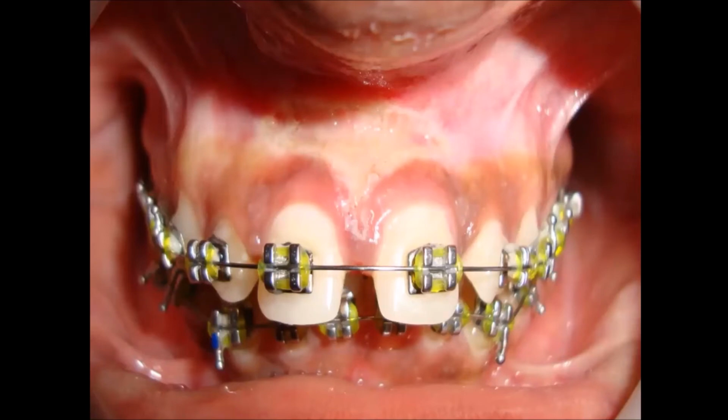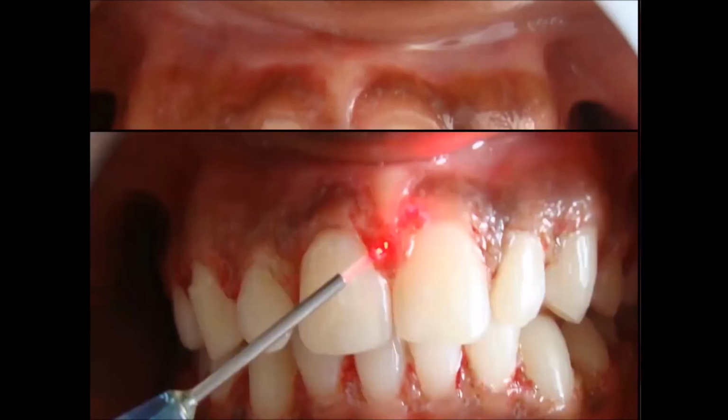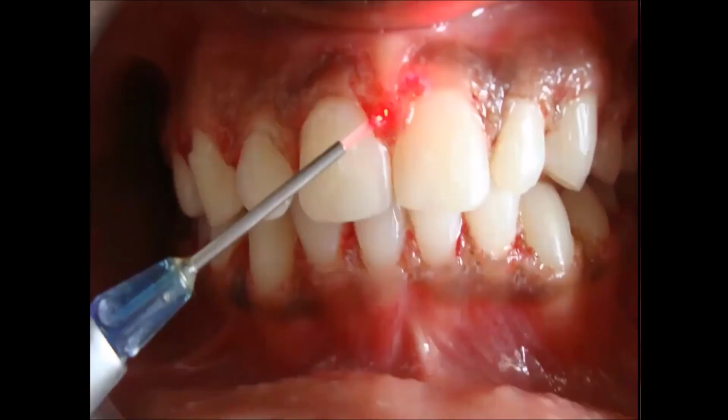Now, what is a frenum? You can roll your tongue on the front portion of your upper lip, and you will see a fold of tissue there. And that tissue removal is what we are showing right now, which is called frenectomy. And then once we completed the procedure, the patient wanted to have much better looking teeth and gums. So what we did was we did a procedure called depigmentation.